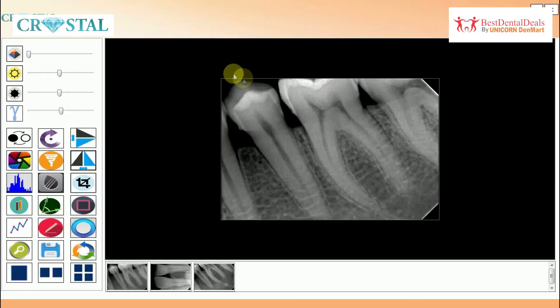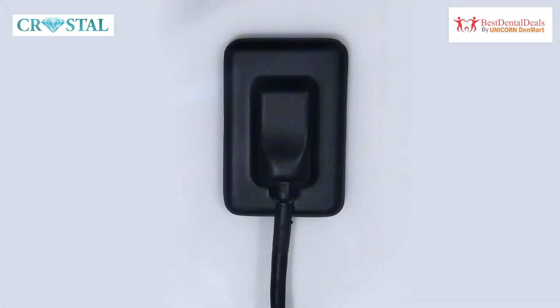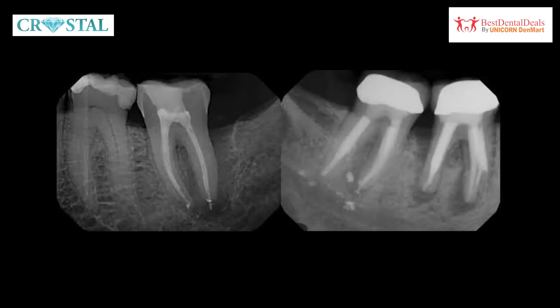The Crystal RVG comes with a high resolution of 20 lines per mm, with superior spatial and contrast resolution, offering better quality images and leading to better diagnosis of micropathologies like lesions and calcifications.